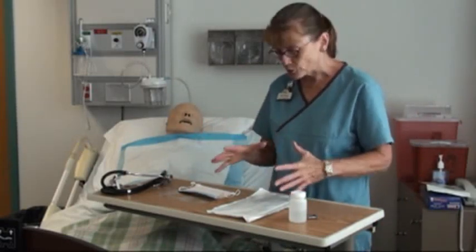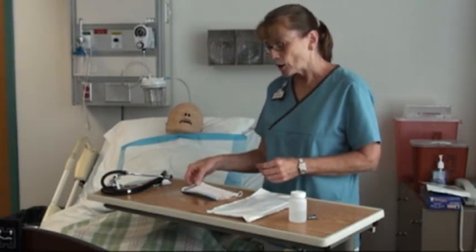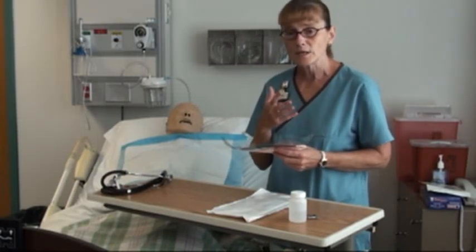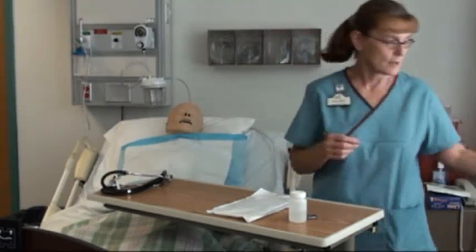Once you've established that, you can wash your hands and gather up all your equipment and come down to the room. Usually we wear a face shield with eye protection when we're suctioning, but because you're going to have trouble hearing me speak, I'm not going to put it on for the skill — but know that you should wear one when you're suctioning someone.